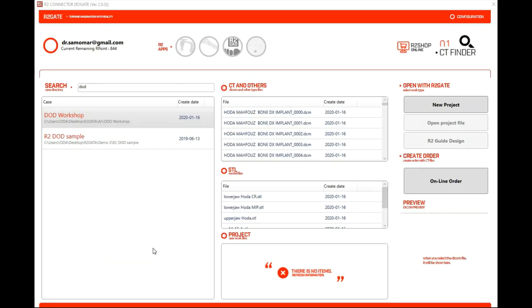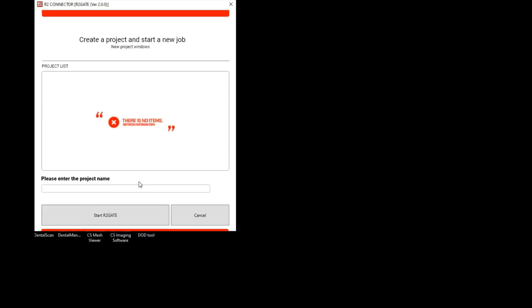To start a new project file, click on New Project, enter the name of the project, and click on Start R2-Gate.